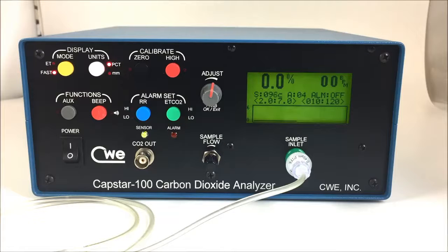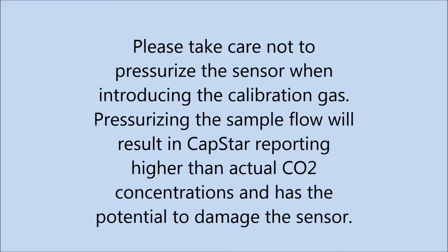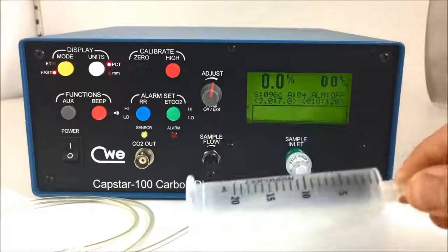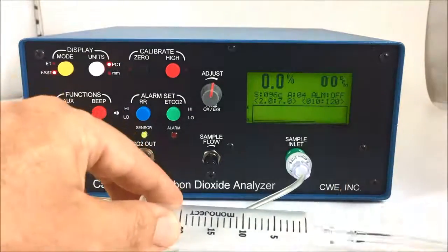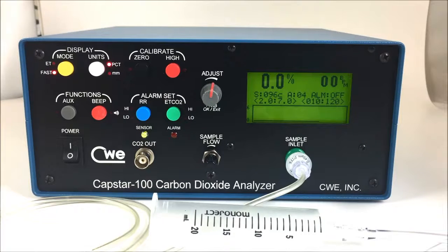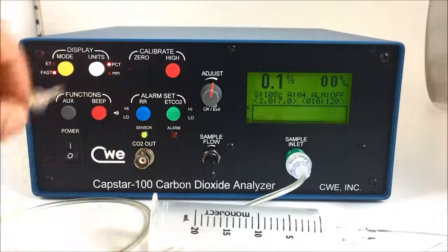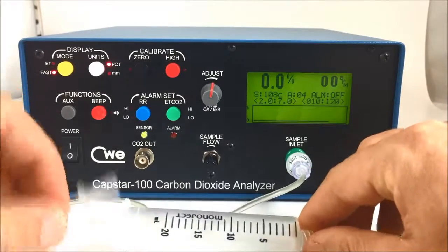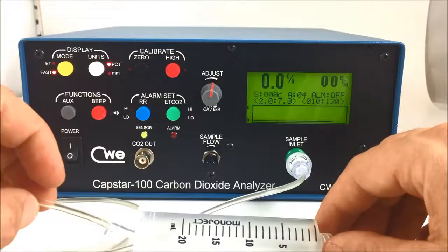We'll move on to span next. For introducing the calibration gas, we prefer a syringe barrel connected to the tubing for our calibration gas. In this case, we're using a 20 milliliter syringe barrel. You could use a 10 milliliter syringe barrel or any fitting that allows for a loose coupling between the calibration gas and the sample inlet tubing. We want to avoid pressurizing the sensor during calibration.